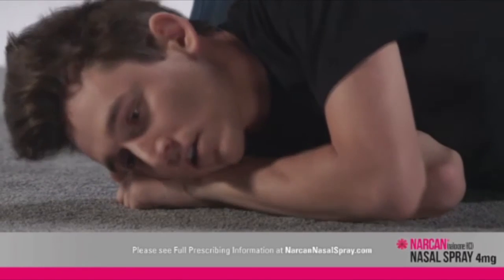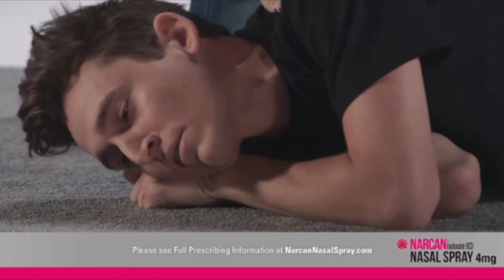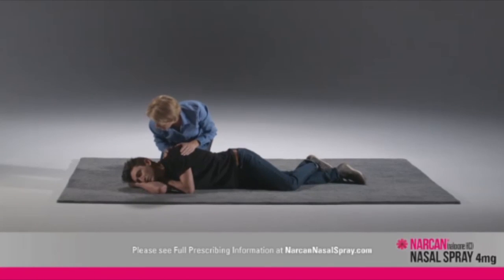When the emergency is over, put the Narcan nasal spray back in its box and throw it away in a place that is away from the reach of children.